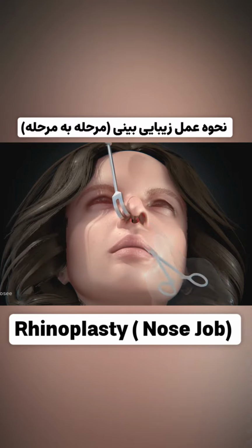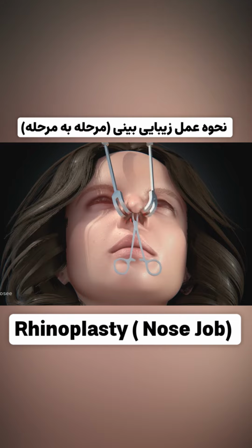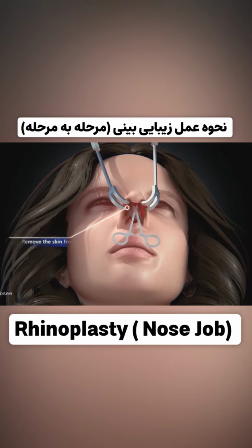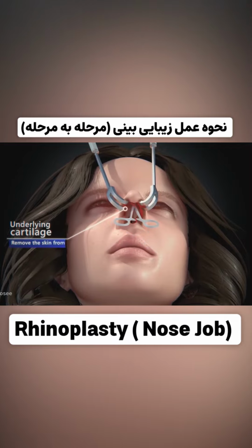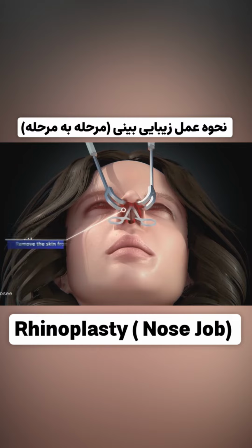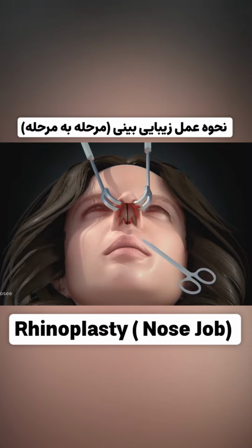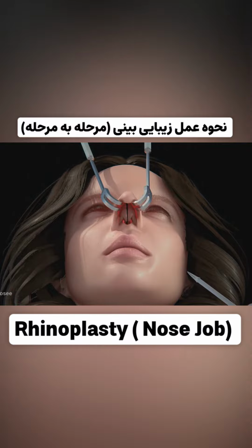With surgical scissors, the doctor will carefully separate the skin along the columella by pulling it upwards. Using surgical scissors and a series of retractors, the physician will continue to very carefully remove the skin from the underlying cartilage, which is the cartilage that extends from the nasal bones to the septal portion. Once the skin of the nose is detached from the nasal bone, the surgeon will be able to make the necessary corrections to the nose.